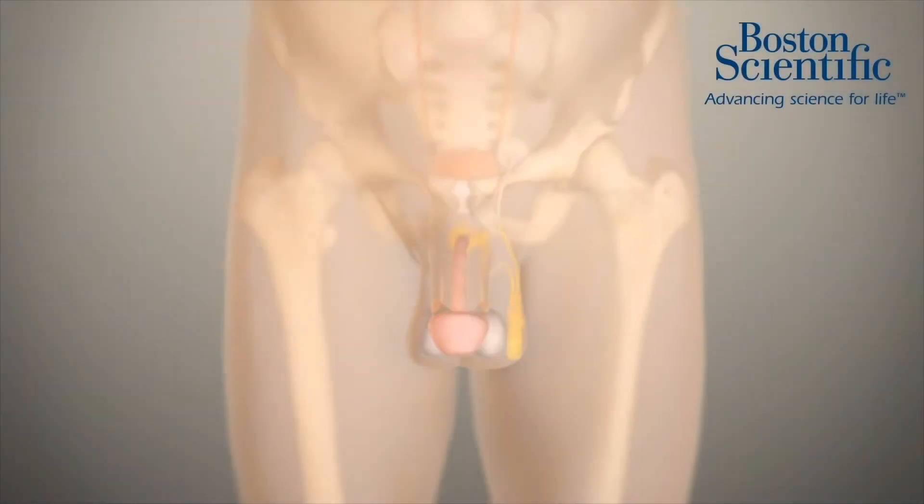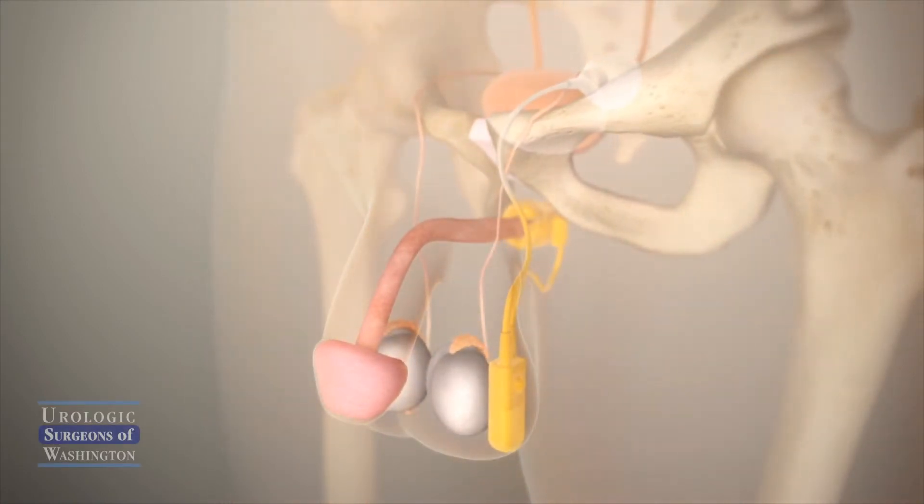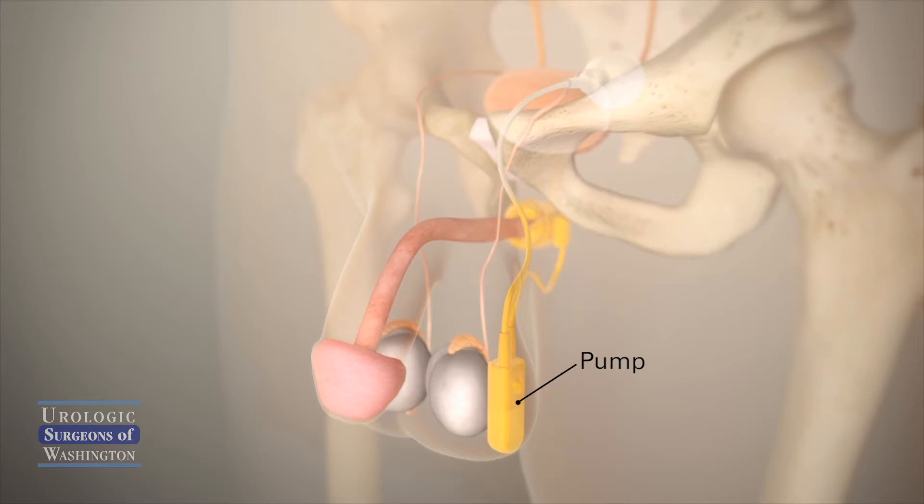This animation will demonstrate proper usage of an implanted artificial sphincter. As you can see, the system consists of three parts, or components: there's the pump in the scrotum, there's the sphincter cuff wrapped around the urethra, and then there's the reservoir, which holds water.